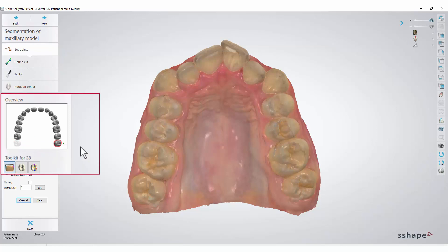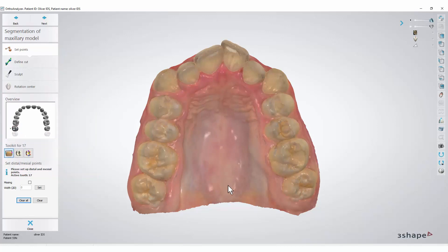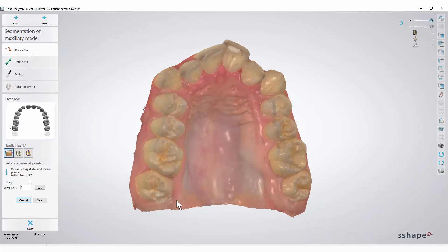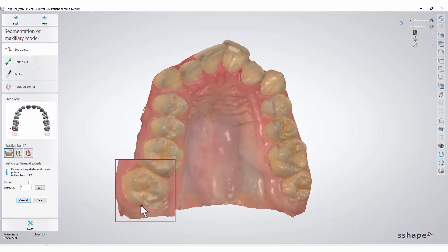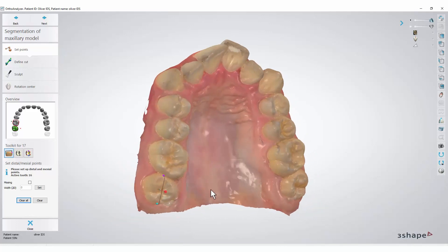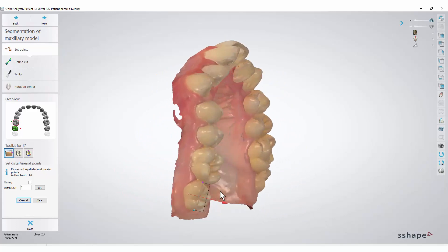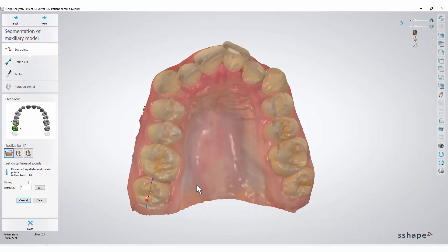Then choose a tooth that you wish to start from — simply click on it in the Overview window. Position the tooth in an occlusal view. Set two points, Mesial and Distal, on the tooth, marking the width of each tooth. The red axis line will automatically be set perpendicular to the width line.